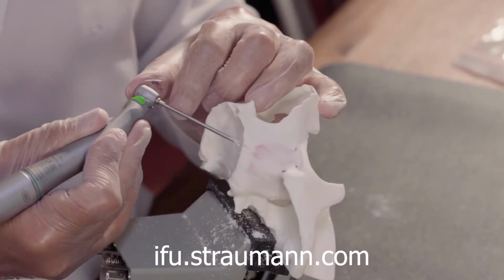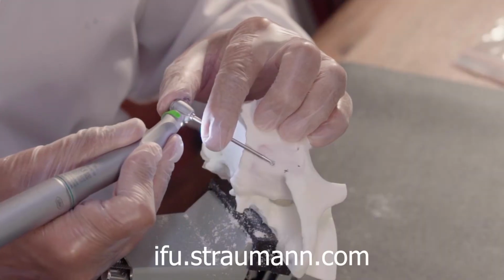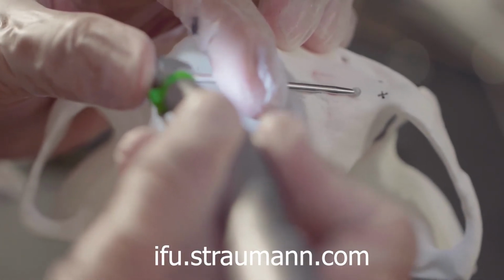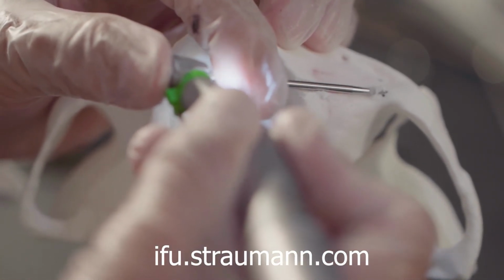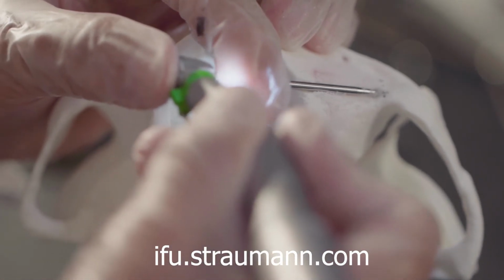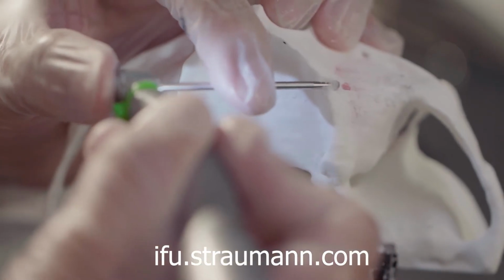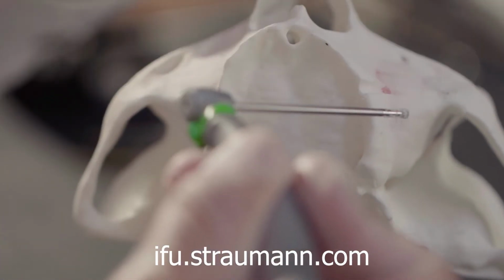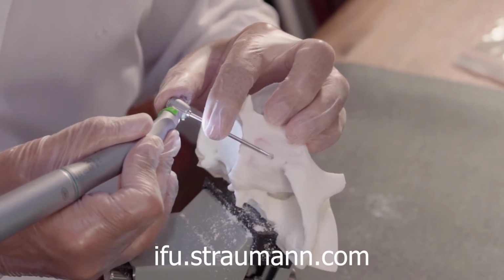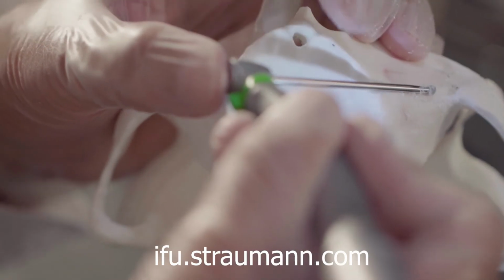It's very nice, but we are keeping this bone integrity, so we try to make our antrostomy, which is the communication with the sinus, as far as possible toward the crestal level. You see, this is the membrane, very, very nice picture. The membrane is still untouched, it's visible, but its integrity is being maintained.